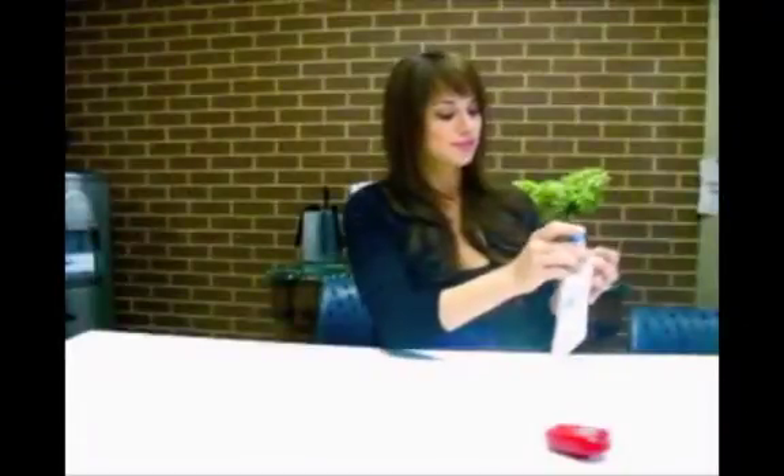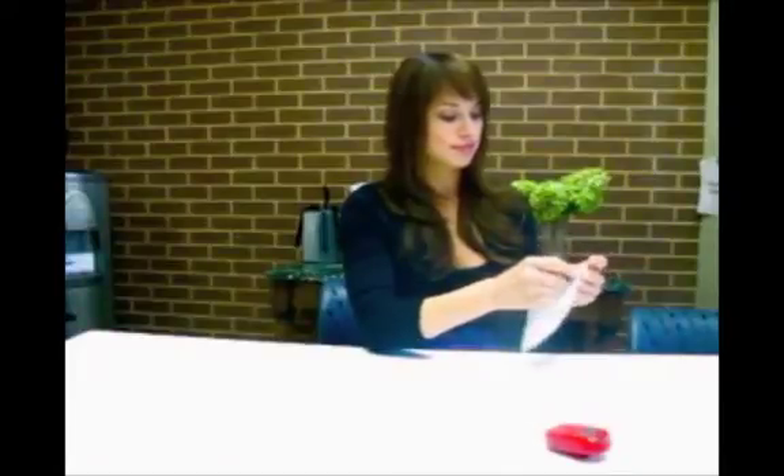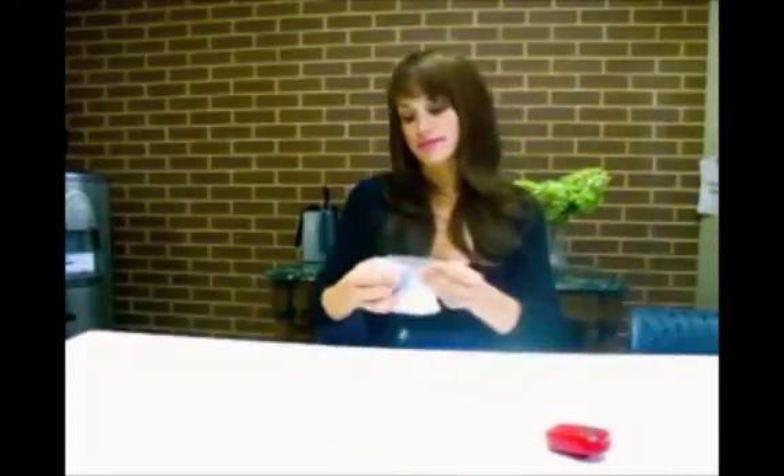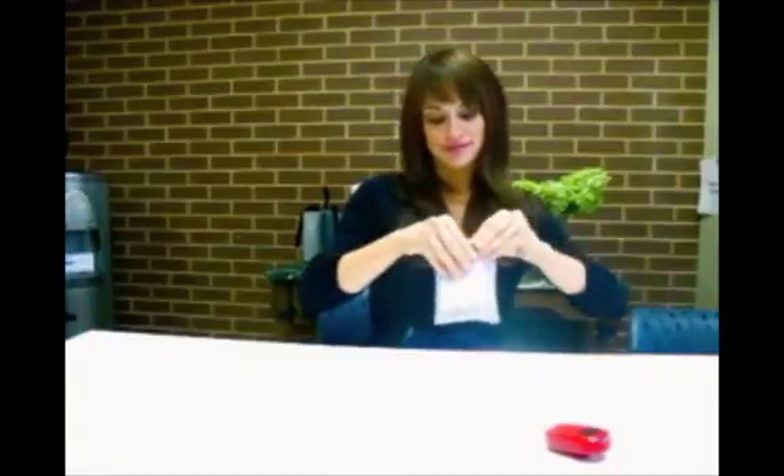Now that you've finished with all 6 tubes, it's time to package them for sending. Once all the tubes are in the bag, peel off the white strip, exposing the sticky layer below, and fold over the flap. Now you have a very secure package for sending.